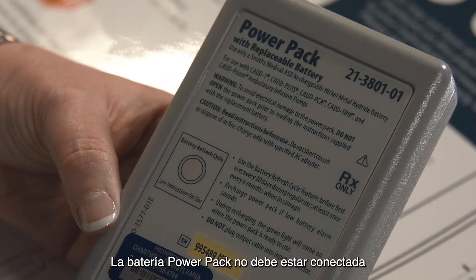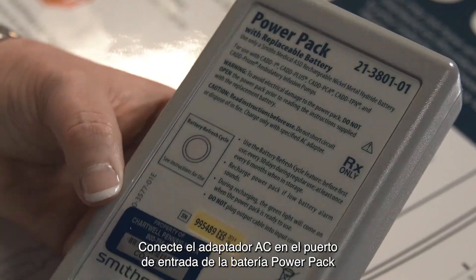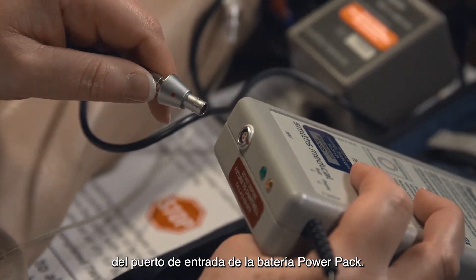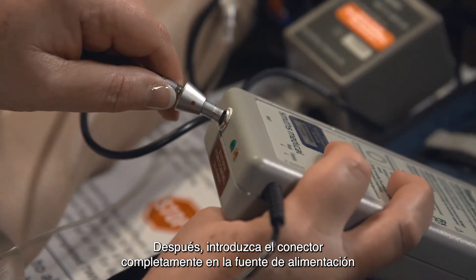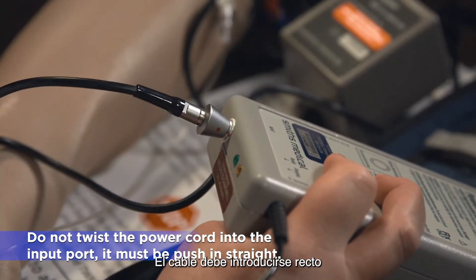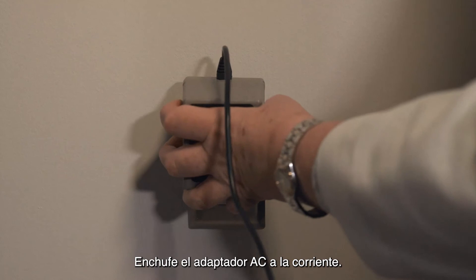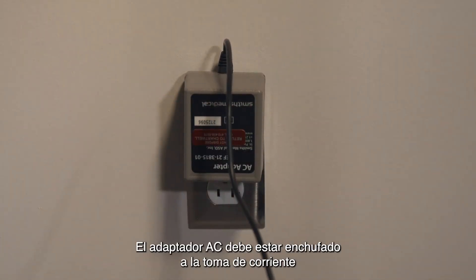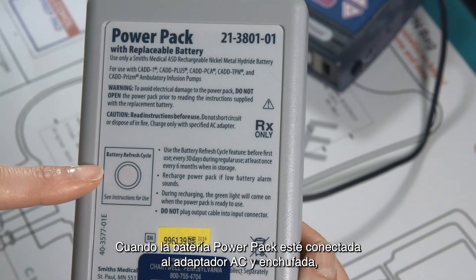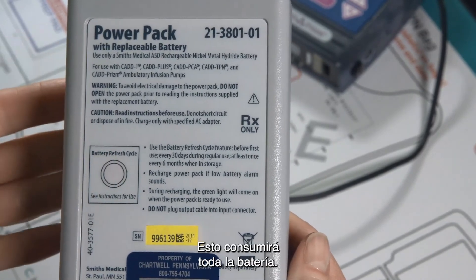The power pack should not be attached to the pump when you refresh your power pack. Attach the AC adapter into the power pack input port by lining up the red mark on the AC adapter and the red mark on the power pack input port. Then push the connector fully into the power pack in a straight motion until it stops. Do not twist or turn the connector — the cord must be pushed in straight so you do not bend the wires inside the cord. Plug the AC adapter into the wall outlet; the AC adapter must remain plugged in throughout the entire refresh cycle. Once connected, press the refresh button on the front of the power pack. This will drain all of the power out of the battery.